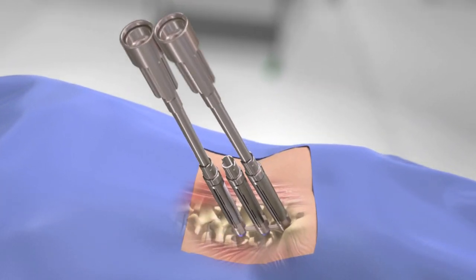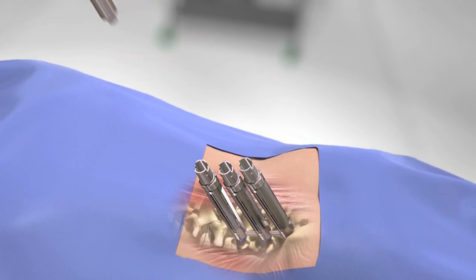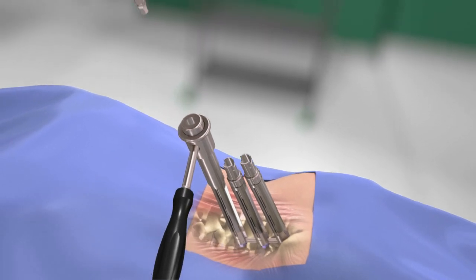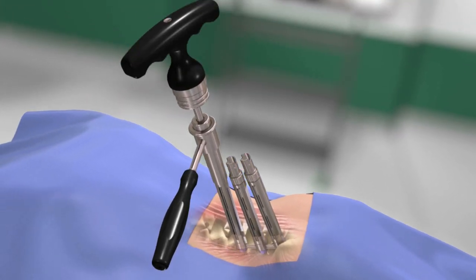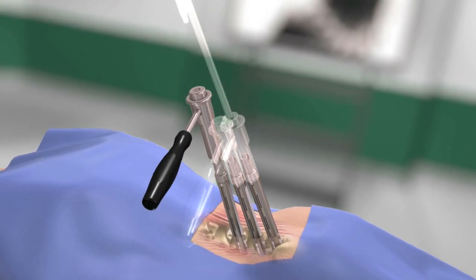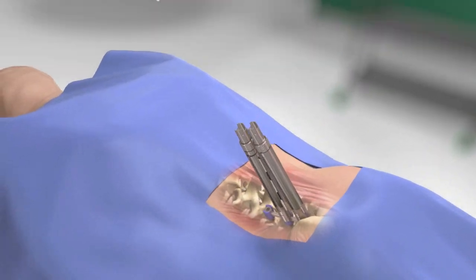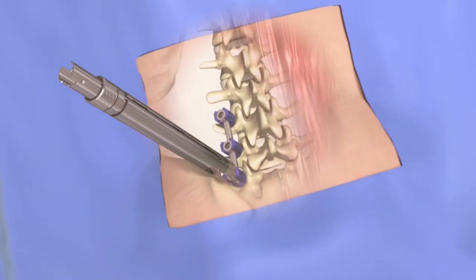Final tightening will occur by placing the counter torque over the top of the screw extensions and tightening the set screws with the final driver. Once final tightening has occurred, screw extensions are removed. The construct is now complete.